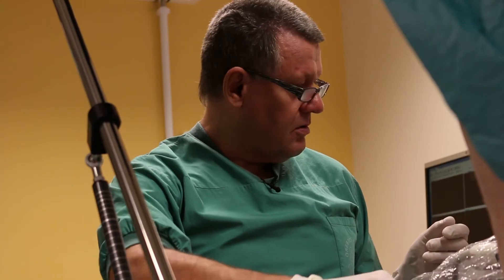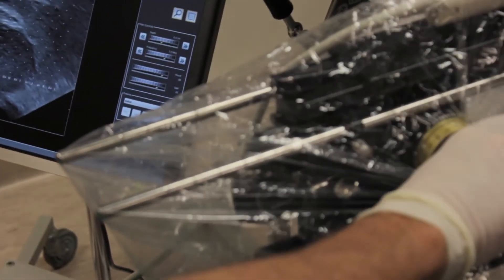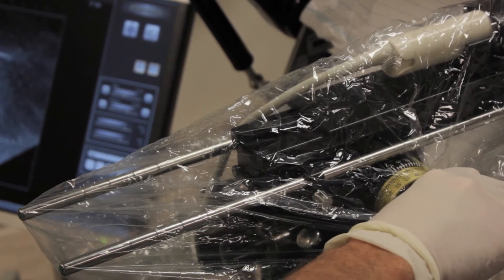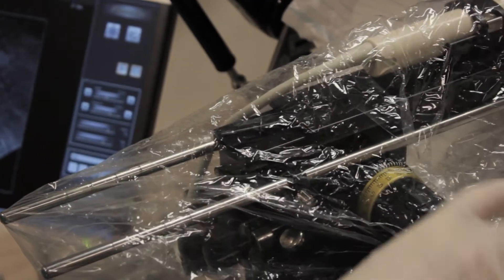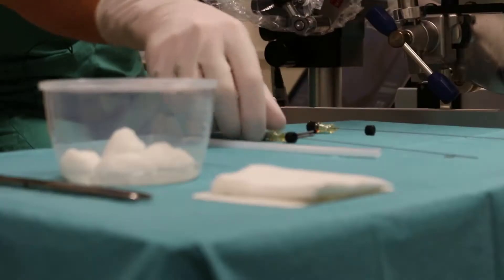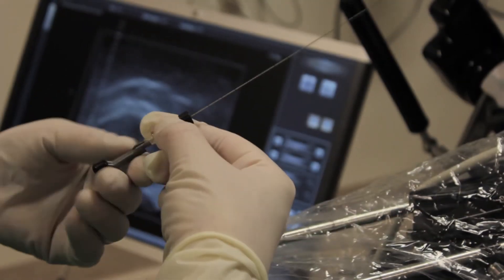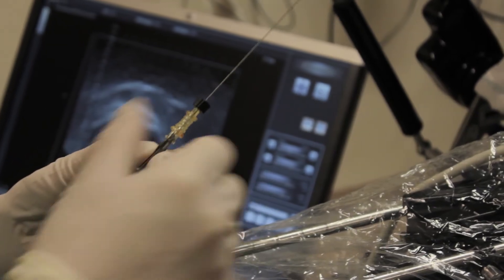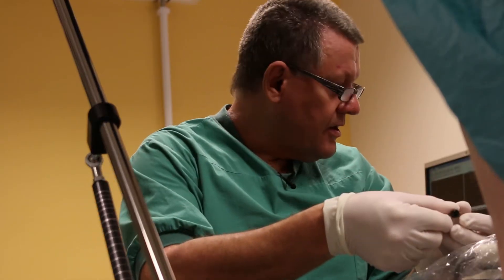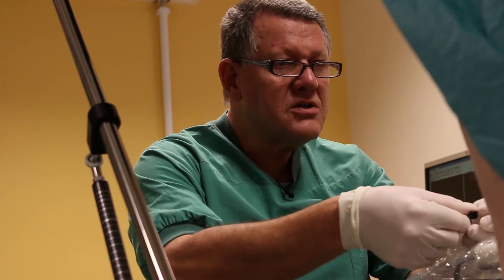Then I position my ultrasound tip exactly in the middle of the base plane and the apex. Now I'm going to put in the gold anchor marker and I will use the D2 position.